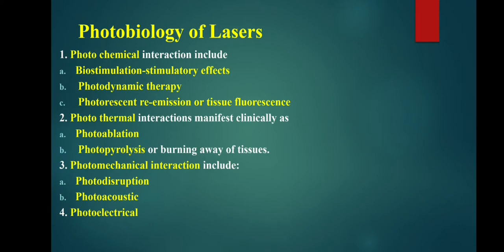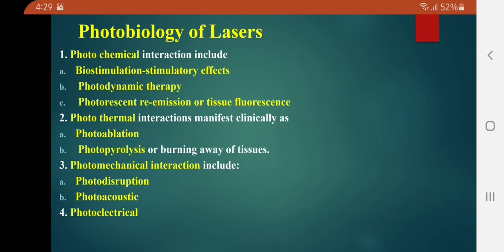Photobiology of lasers. The interaction of non-ionizing radiations with biomolecules and the resulting biologic reactions is known as photobiology. The major reactions are photochemical, which include biostimulation, which means laser effects on biochemical and molecular processes that normally occur in tissues, such as healing and repair, and photodynamic therapy, which is the therapeutic use of lasers to induce reactions in tissues for the treatment of pathologic conditions, and photofluorescence or re-emission, or tissue fluorescence, which may be used as a diagnostic method to detect light reactive substances in tissues. Photothermal interaction manifests as photoablation and photopyrolysis.